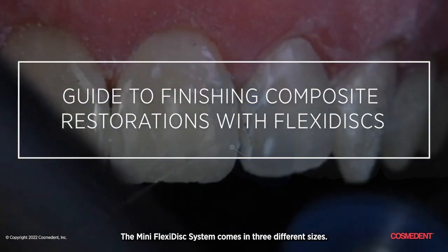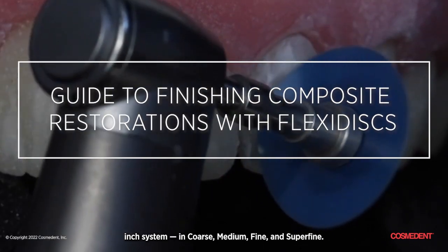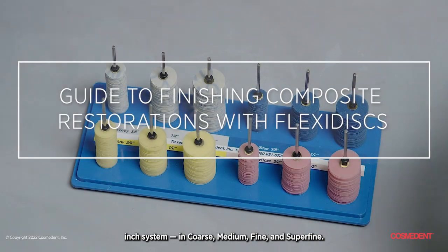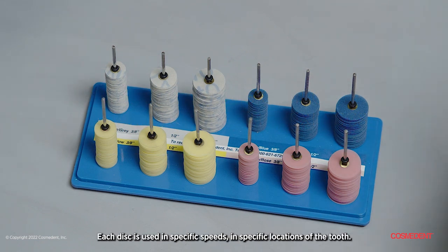The Mini FlexiDisc system comes in three different sizes: three-eighths, five-eighths, and half-inch, available in coarse, medium, fine, and superfine grits. It's completely color coordinated to the rest of the system. Each disc is used at specific speeds and specific locations of the tooth.